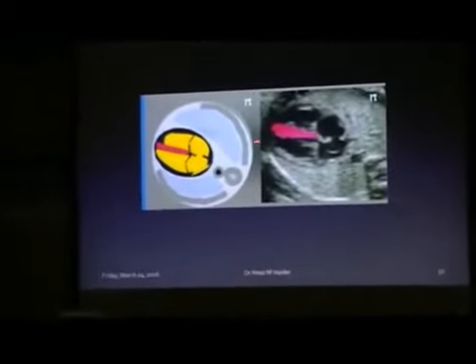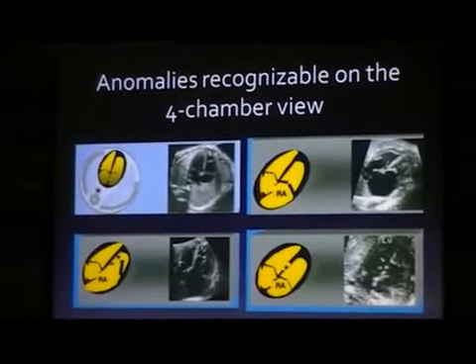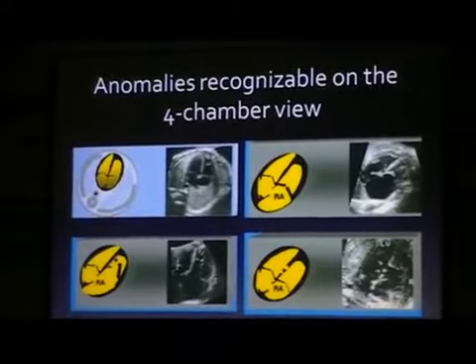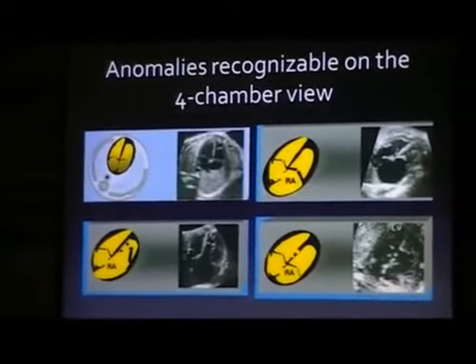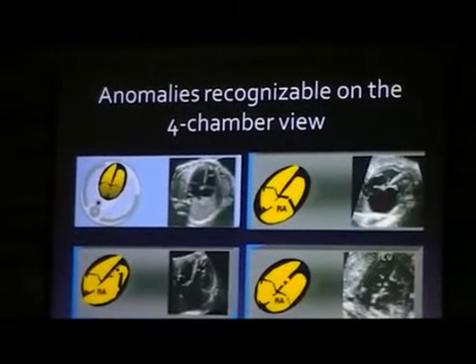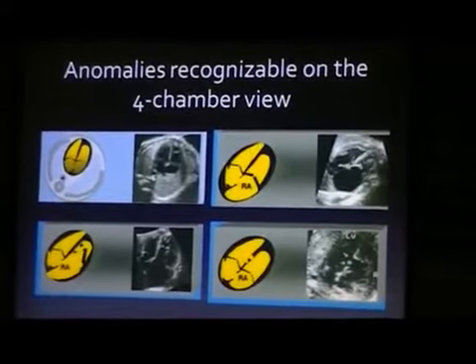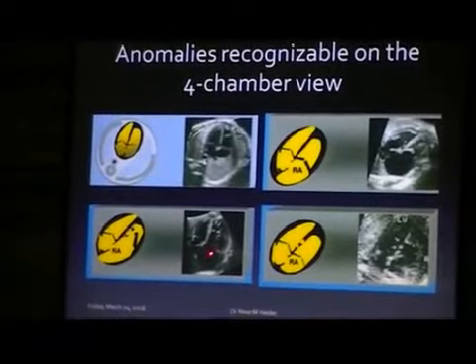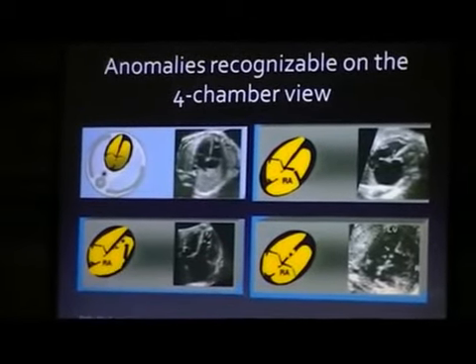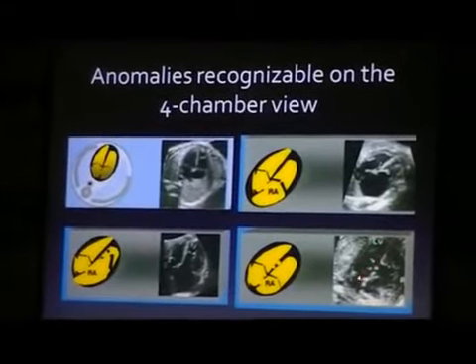What abnormalities can we find in the four-chamber view? If the four-chamber view is normal, we can exclude 60% of congenital cardiac anomalies. Here, the right atrium is hugely enlarged, and this is due to tricuspid atresia or tricuspid insufficiency. Here the right atrium is enlarged, and the leaflet of the tricuspid valve is abnormally inserted — this is Ebstein's anomaly. Here, this is a ventricular septal defect — the ventricular septum is not intact, and here is the defect.